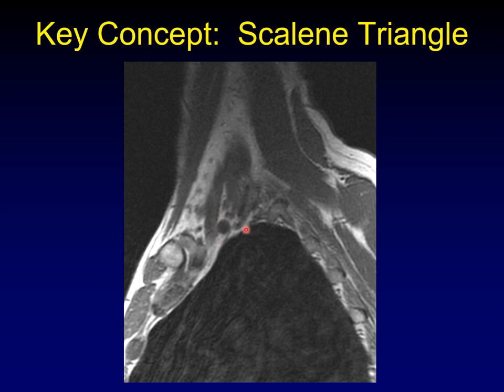When you begin your analysis of the brachial plexus, start here. Take an unenhanced T1-weighted sequence, find this triangle, and use it as your reference point. From here you can follow the nerves medially back to the cervical nerve roots or out laterally into the arm, and link your T1 and T2 sequences to find nerves on fat-suppressed T2 where they might otherwise be hiding. This is the most important takeaway from this lecture.